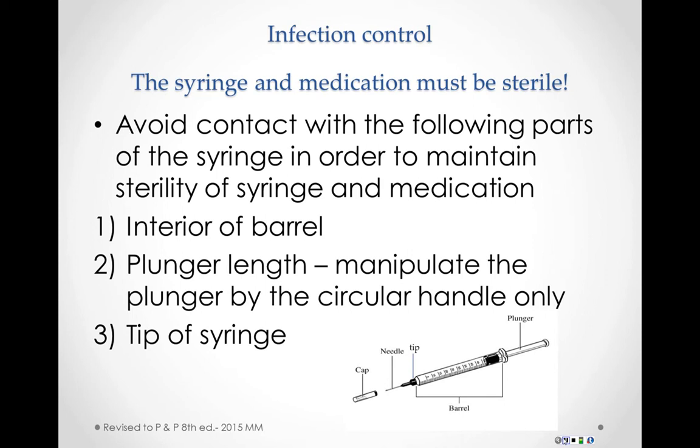All of these areas come in direct contact with the medicine. Bear in mind that an item is either sterile or not sterile. There is no state of almost sterile. If the syringe or the needle becomes contaminated, discard it and start over. In addition, please note, sterility cannot be restored by wiping a contaminated item with an alcohol pad.